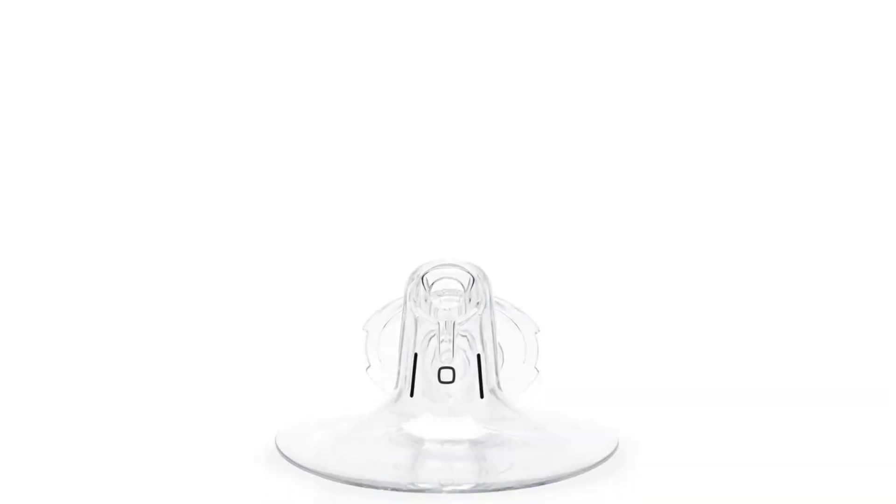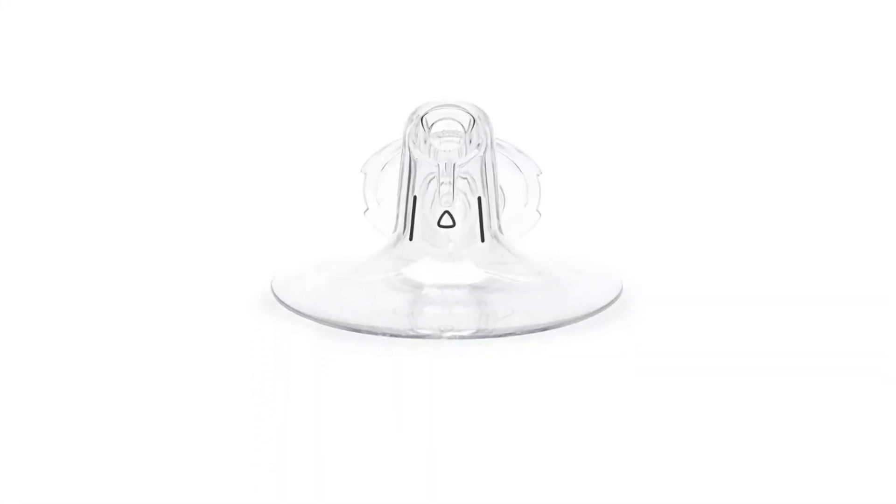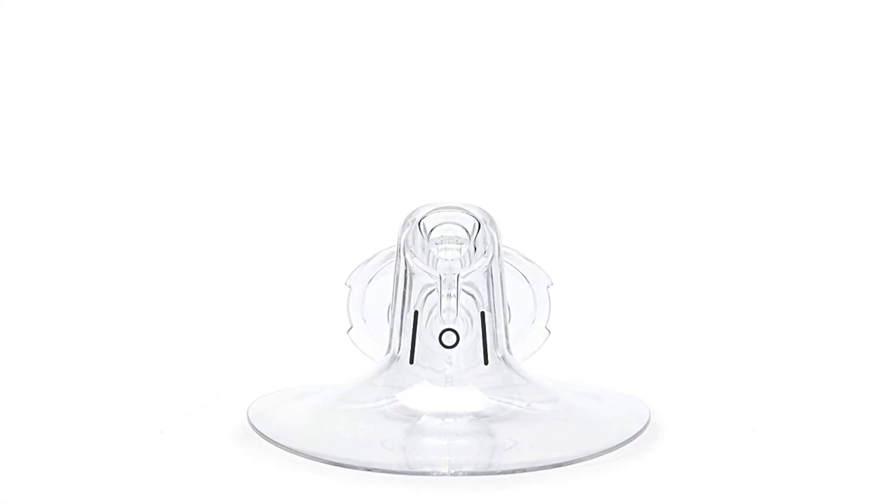So you get two flange sizes: the 28 millimeter, which is the square symbol, and the 24 millimeter, which is the triangle. I personally had to buy my own flanges because the ones it comes with were way too big — I use a 21 millimeter flange and that works well for me. It also comes with breast pump seals, bottles, a pour spout, and a little topper that goes on top of the pour spout.